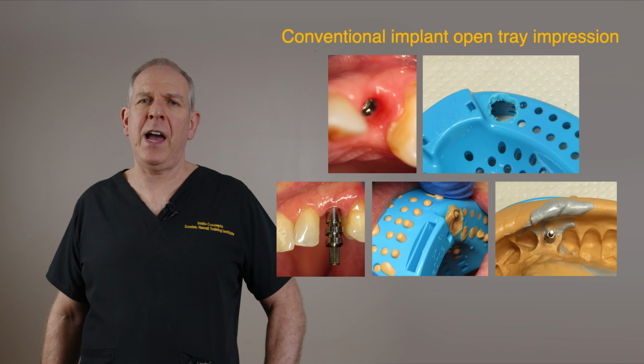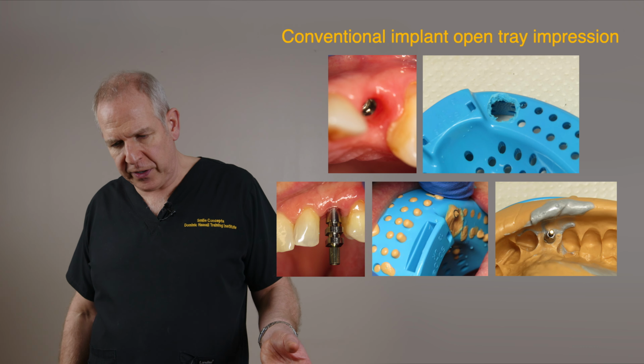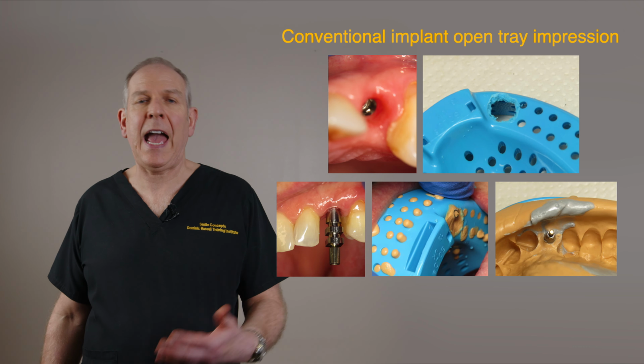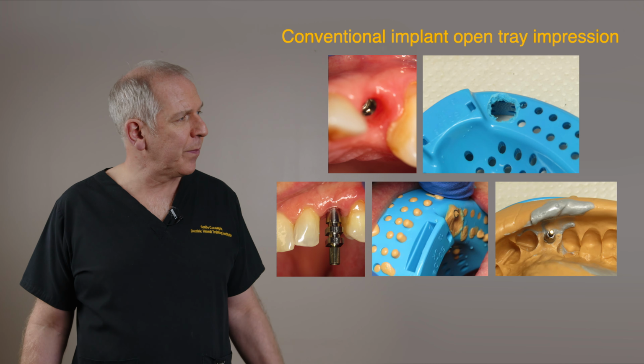Most of my cases now are done digitally, but on the courses we teach in terms of implants, we still cover conventional impression taking and we cover digital as well, because we're in this transition phase between the two.